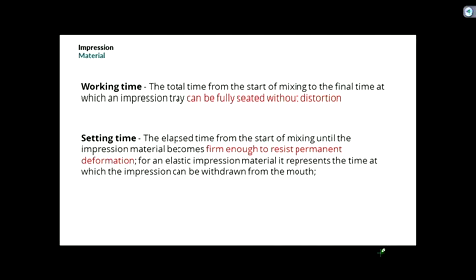Okay? You don't want to have that light body sitting on the teeth too long, then you're sitting there waiting for your classmate to load the tray, because the material in the mouth will set faster. Why does it set faster in the mouth? Because it's warmer. It's in the oral environment. And then the set time is the elapsed time from the start of mixing until the impression material becomes firm enough to resist permanent deformation. For an elastic material, it represents the time at which the impression can be withdrawn from the mouth. And for the Aquasil PVS that we use, that's going to be 5 minutes.